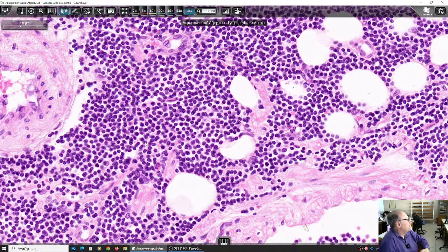You remember these markers from the theory? For small cell lymphocytic lymphoma: CD5, CD23, but not cyclin D1, because cyclin D1 positivity is compatible with the diagnosis of another type of low-grade B-cell non-Hodgkin lymphoma known as the mantle cell lymphoma.